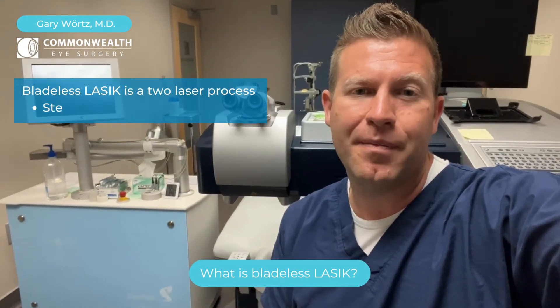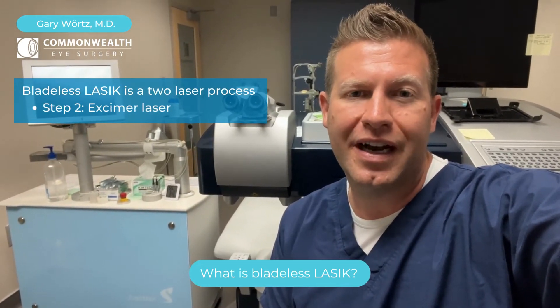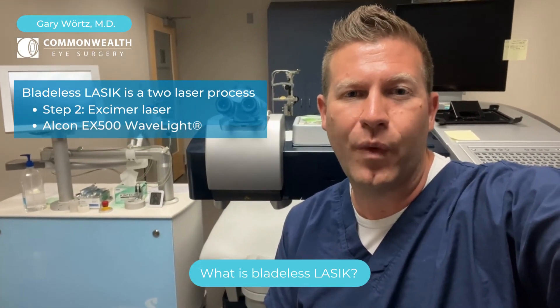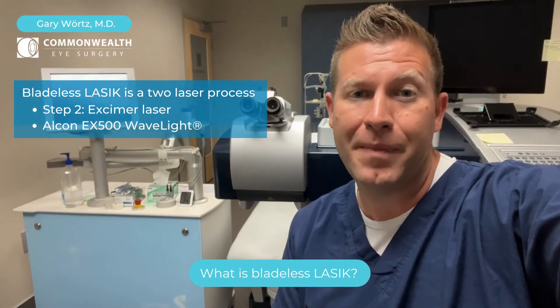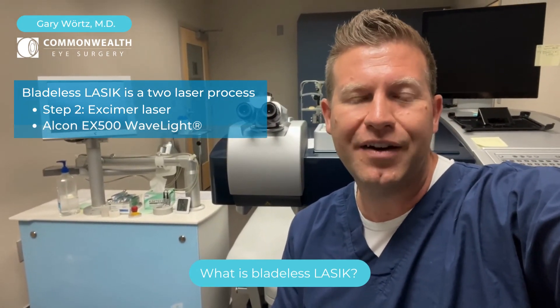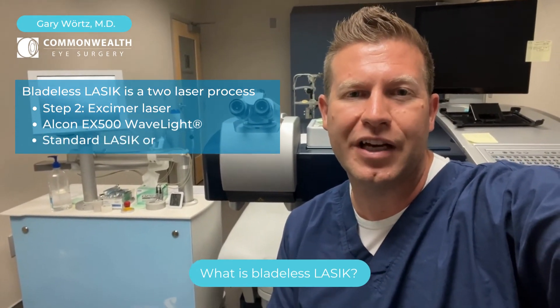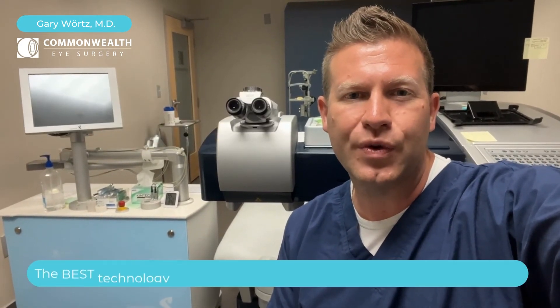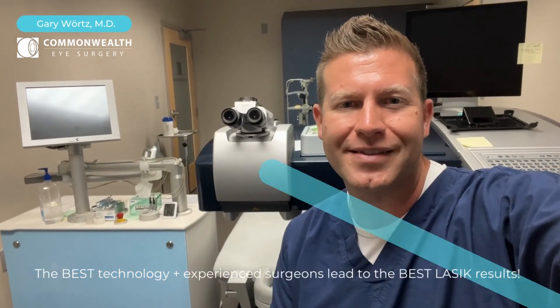The rest of LASIK is the same. We use the excimer laser — we actually have the brand new Alcon EX500 WaveLight laser, which is amazing. It provides both standard LASIK as well as Contura topographically guided LASIK. We love having great tools because it helps our patients do their very best.